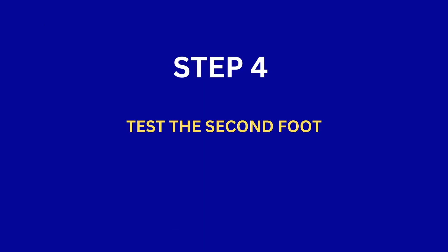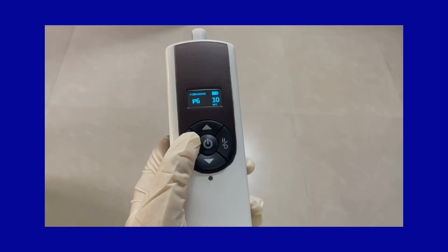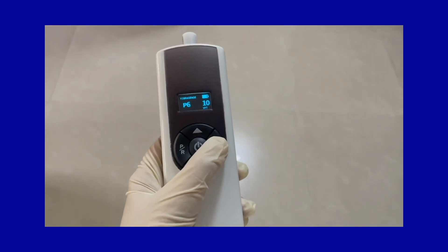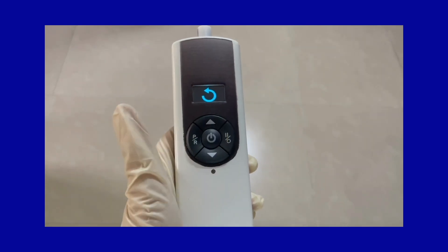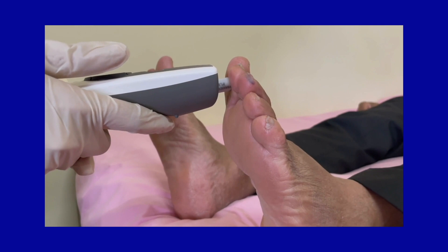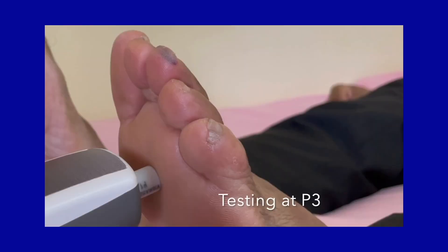Step 4: Testing the other foot. Before testing, erase the data of the previous leg by long pressing the pause/reset button. Now repeat the same procedure of testing for the other foot.